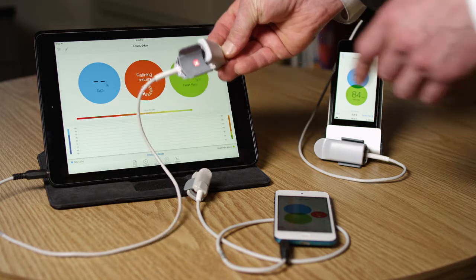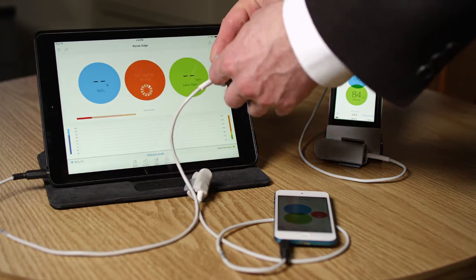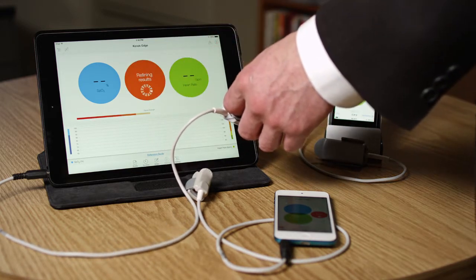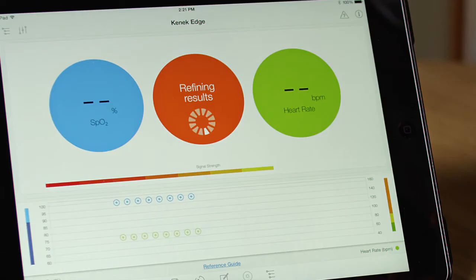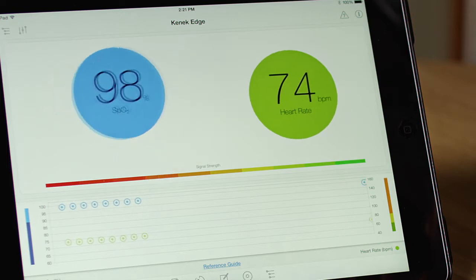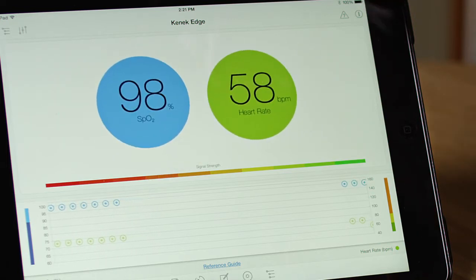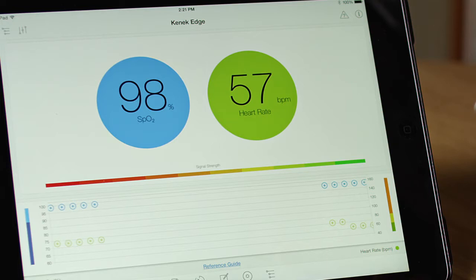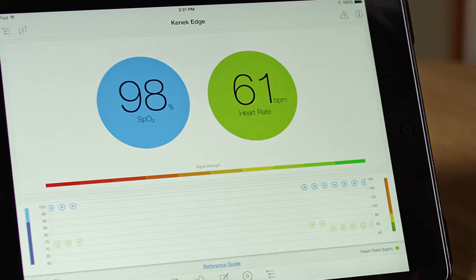I can put my finger into the sensor and it will send light through the tissue of my finger and analyze the signal, giving it a few seconds to refine the results that it's measuring. And now it shows my blood oxygen level at 98% and my heart rate at 57 beats per minute.